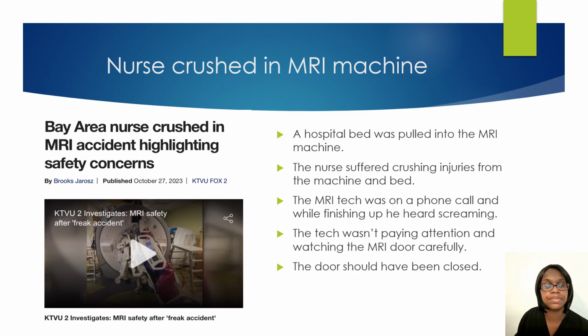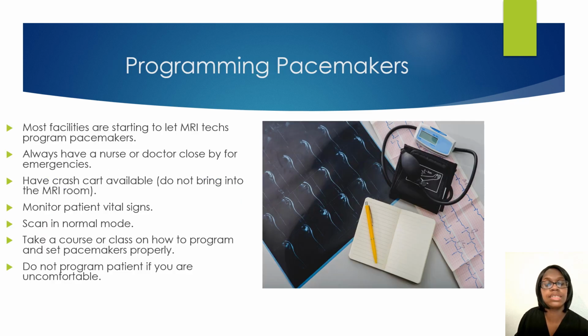If you work at a facility that wants you to program pacemakers, you want to make sure that you are properly trained, that you know how to program it. If you don't, feel free to speak up. Tell someone you need more time to train, or tell someone that you are not comfortable with programming pacemakers. If you do have to, make sure you have the crash cart, make sure the patient is being monitored, make sure that you program it back into the pacemaker mode.